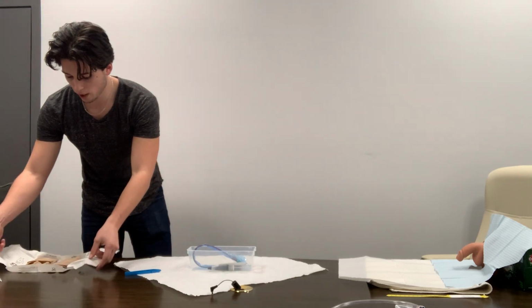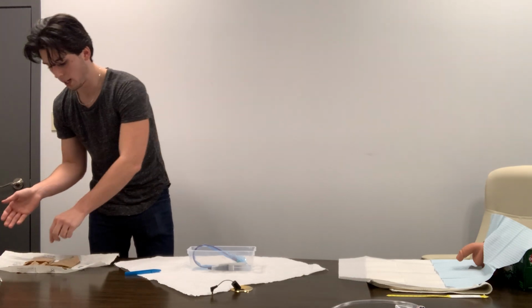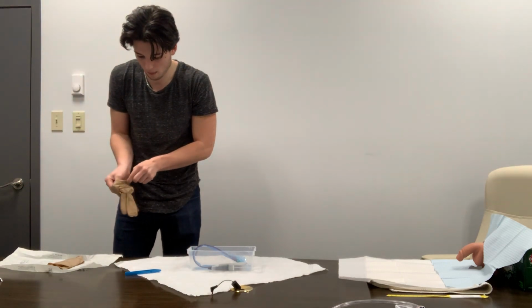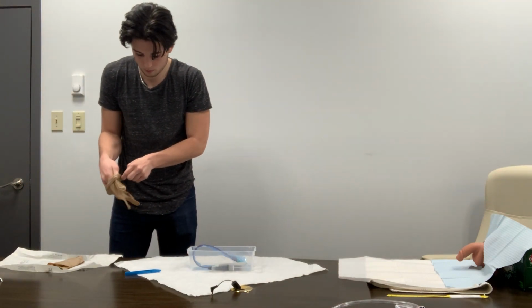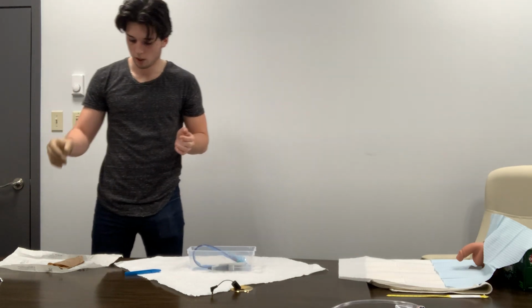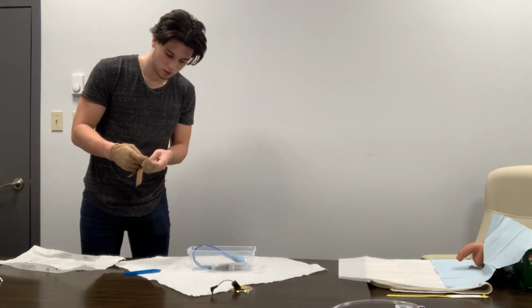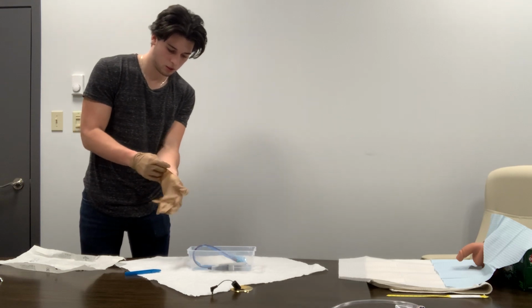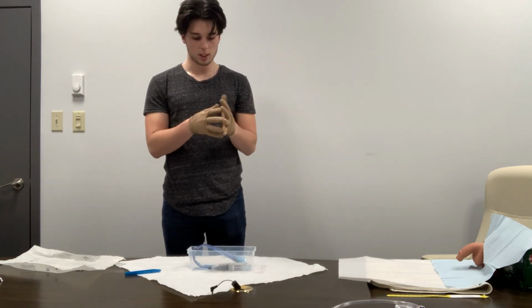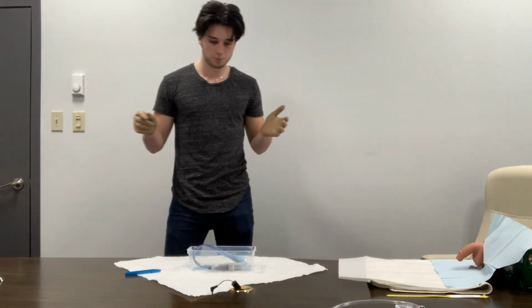We're going to spread them wide open, and once it is spread wide open, we're going to start by donning our right hand glove. So I'm going to grab the glove and place my hand inside. And once this glove has been put on, we can go ahead and grab our second glove. And then now, since it's sterile to sterile, we're able to adjust any imperfections in our gloves. So now we can grab our sheet here and just throw that aside as well.